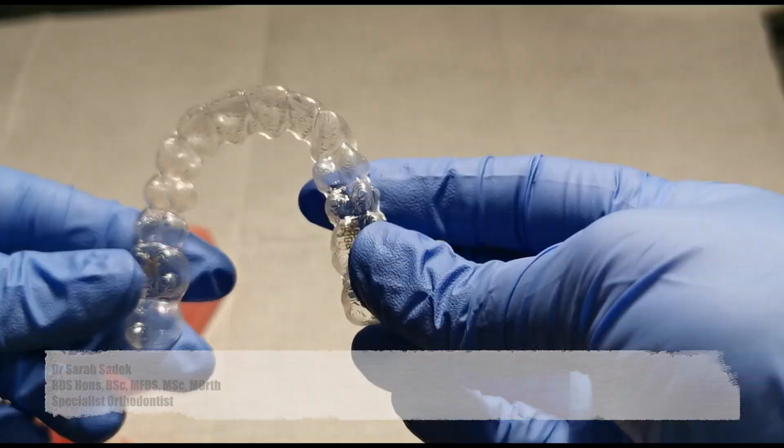Invisalign is a way to straighten your teeth. It involves the use of clear aligners. The aligners look like this.